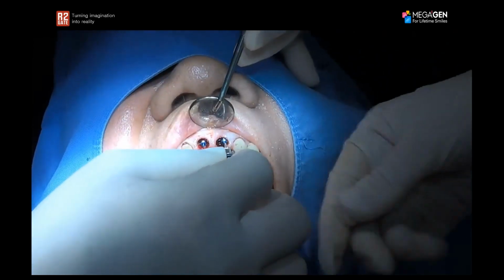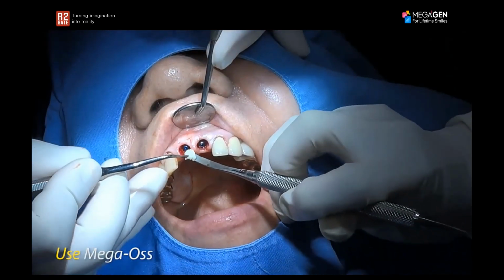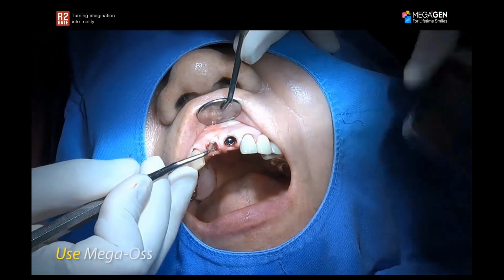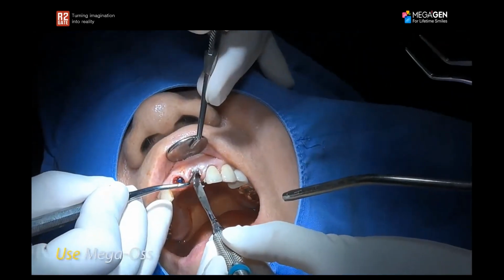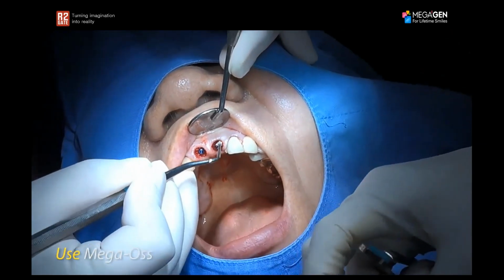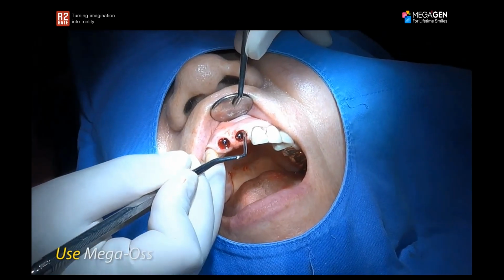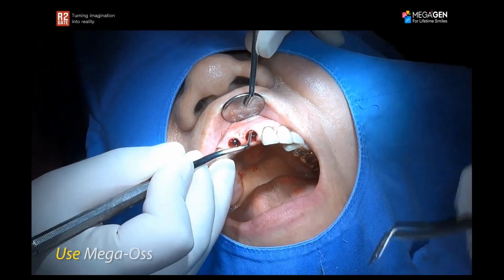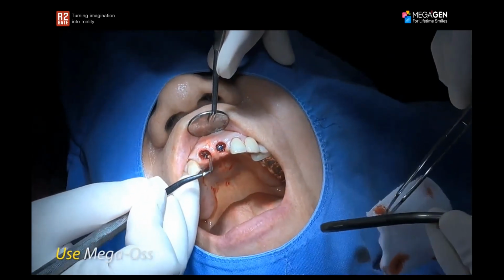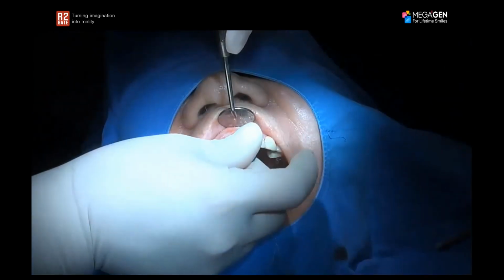And now I'll start to close the openings of my implants, close the connection. I'll place and pack bone in the jumping gap between the implant and the wall of the socket. And it's always recommended to do that just to make sure that we preserve the volume of the tissues. I'll pack my bone really nice in position. Again, make sure that this bone is nicely compacted.